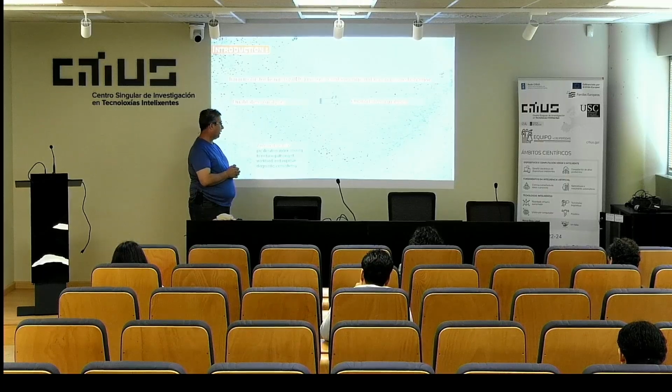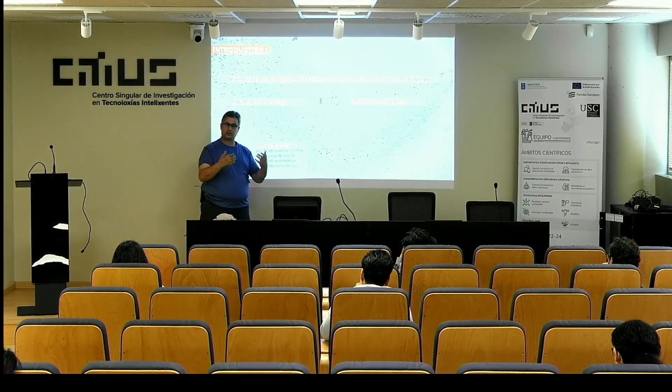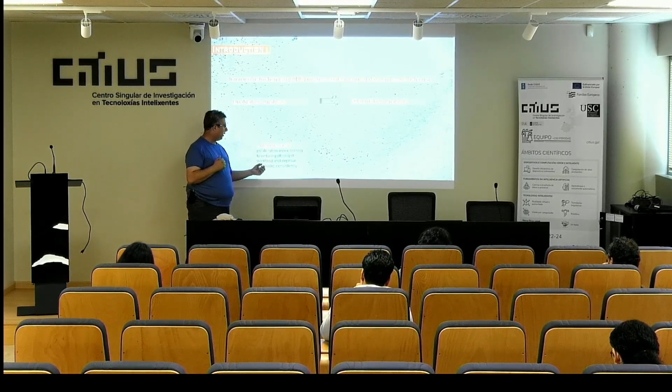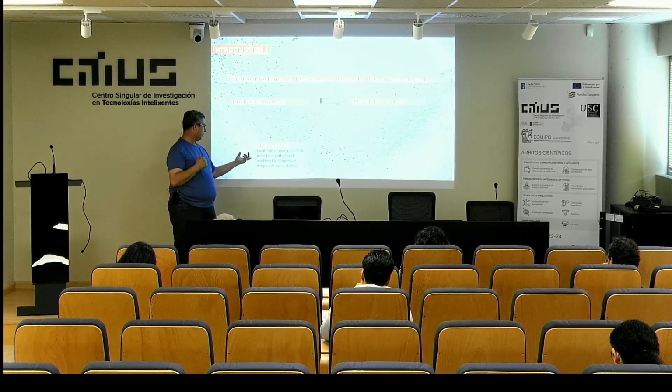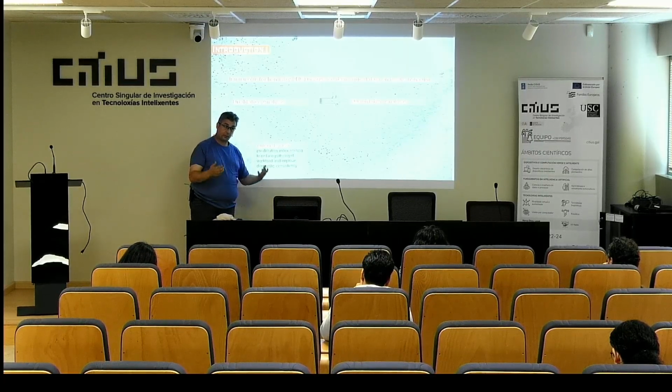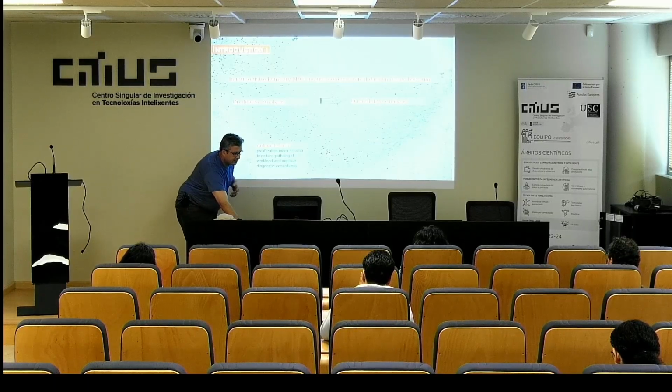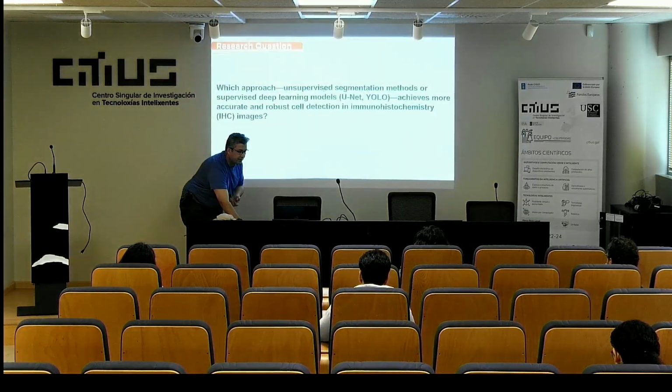It's easier for the decision maker while they treat or diagnose and check the prognosis of the types of cancers. Already we deal with Ki67, which is an approved biomarker, a protein. This protein is used by the clinical side to detect the type of cancers and to detect how progressive it is in the field.